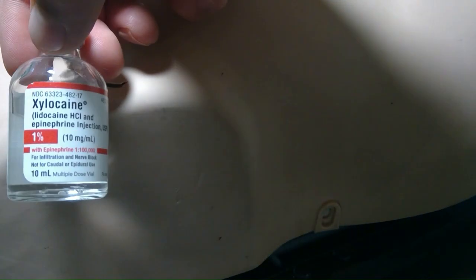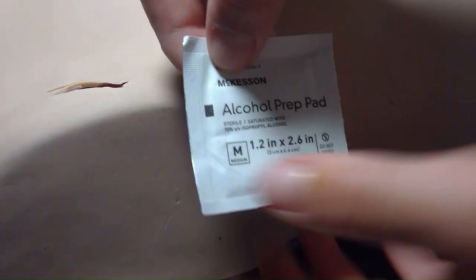The first thing we do is start by taking our needle and opening it. If you have a needle with a paper bag you can pop it like that, but this one is different so I'm just gonna open it and have that ready to go. Today we're just gonna be training with some expired xylocaine, a local anesthetic.